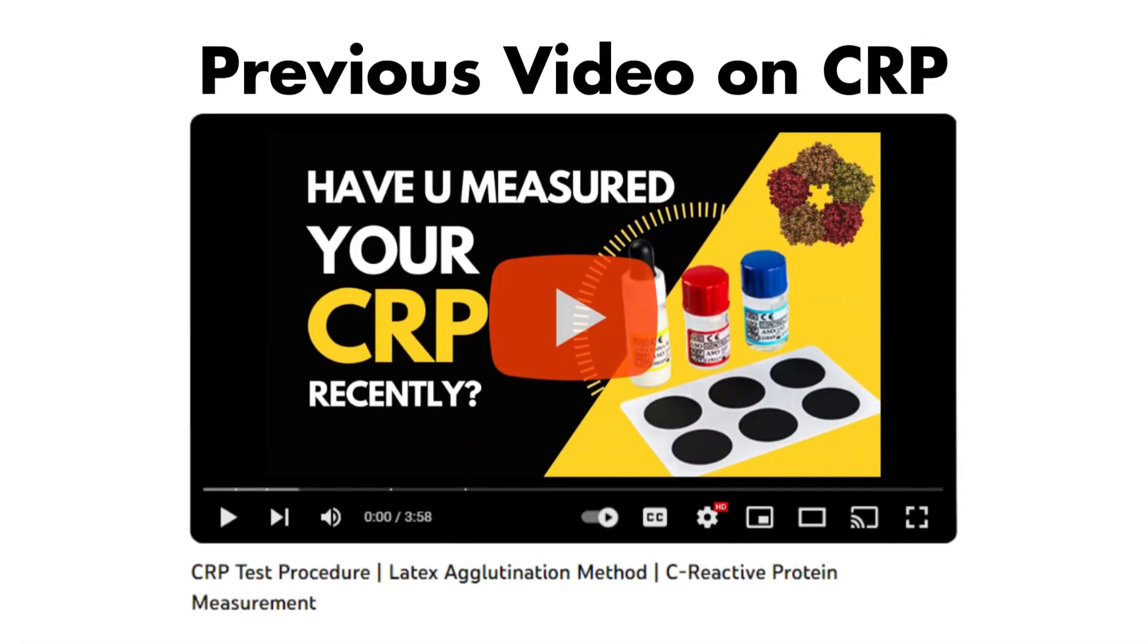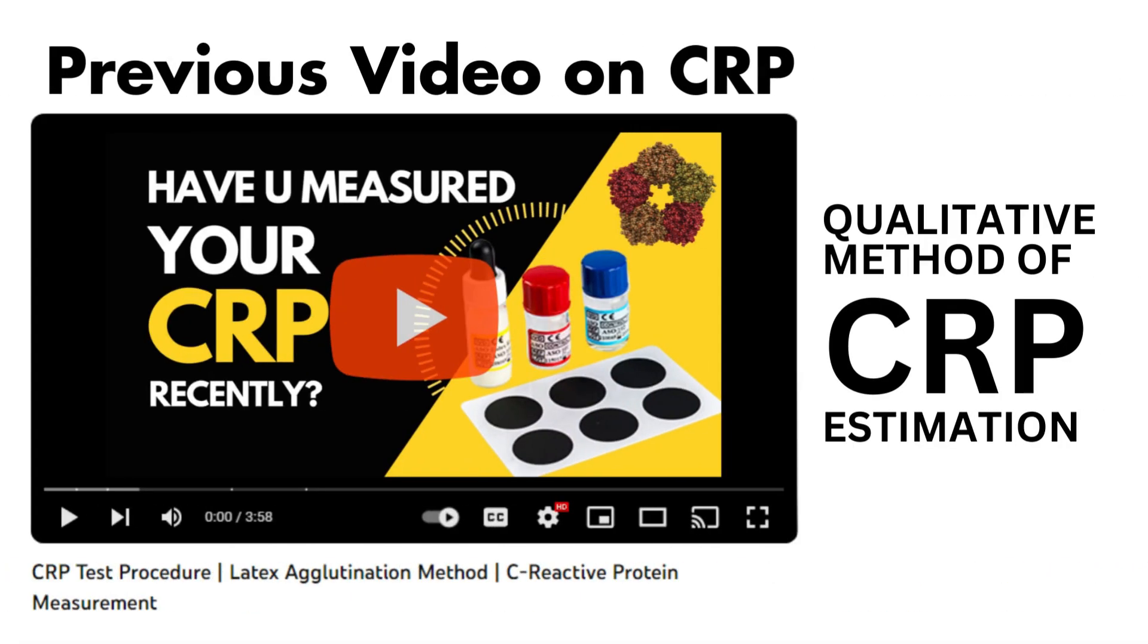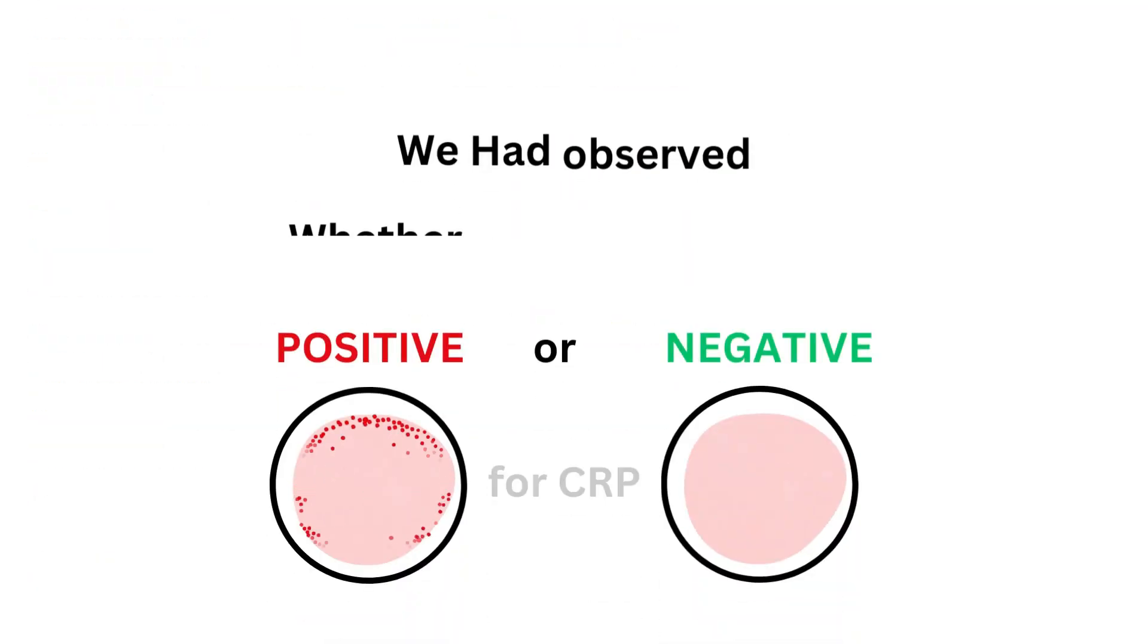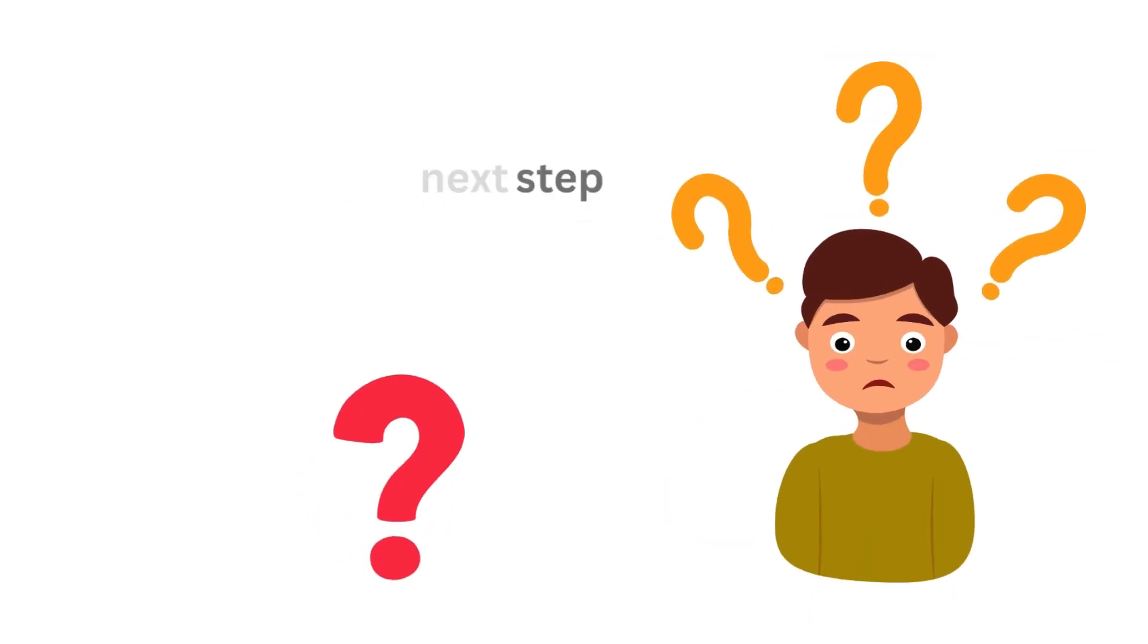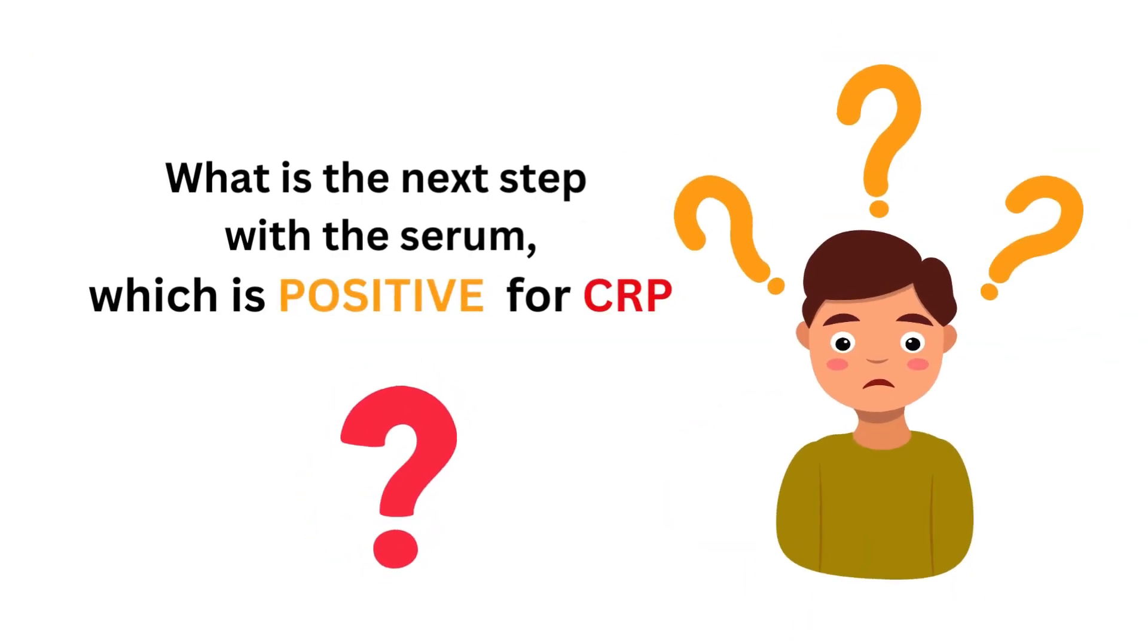In the last video of CRP series, we demonstrated the procedure of qualitative method where we observed whether the serum is negative or positive only. Today we will learn what is the next step after we found the serum positive for CRP.